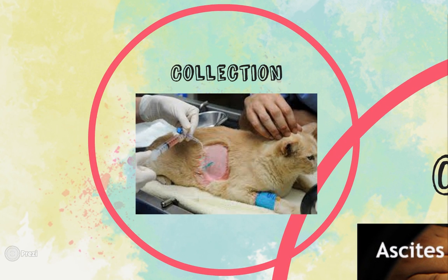And then this is a cat undergoing thoracocentesis. The main thing is a lot of times when these animals come in for this type of centesis, maybe sedation is needed. A lot of times they don't need sedation. Typically, they're so lethargic and just not feeling well that they tend to stay happily in place while the fluid is removed from their thorax or their abdomen.